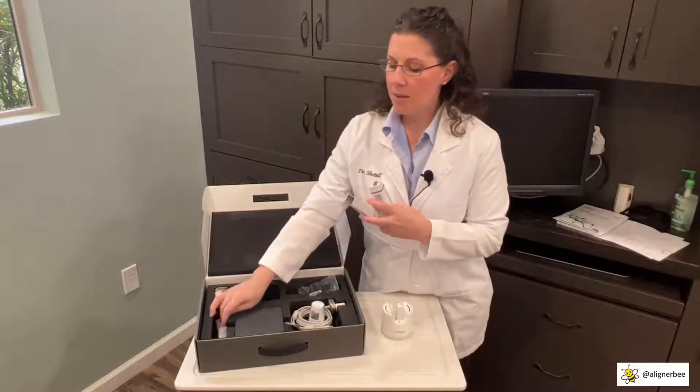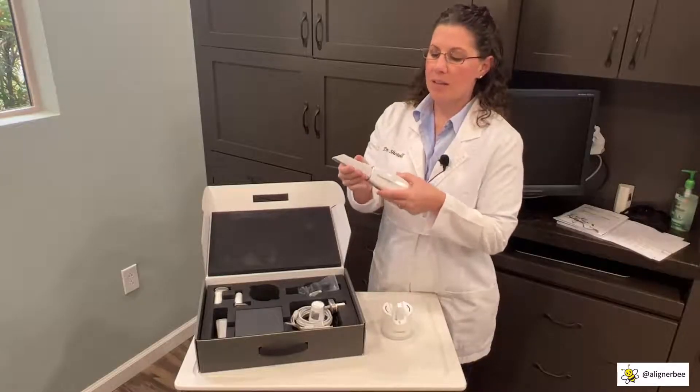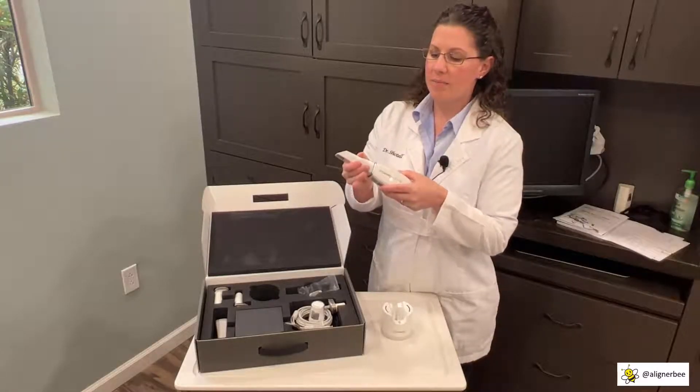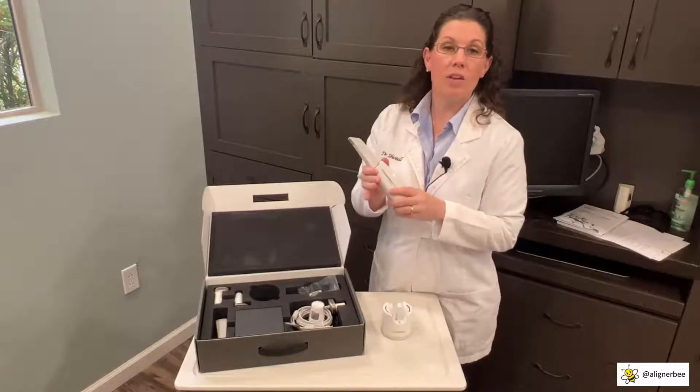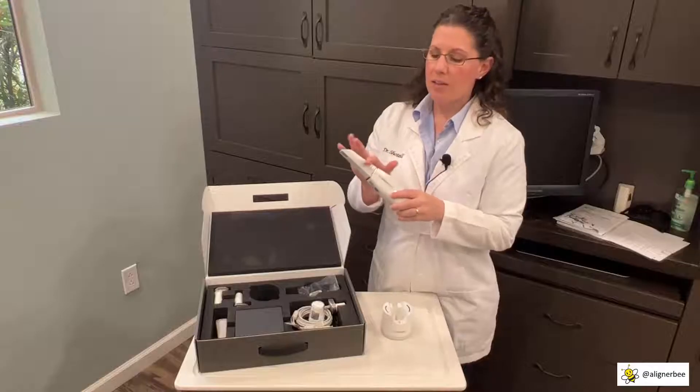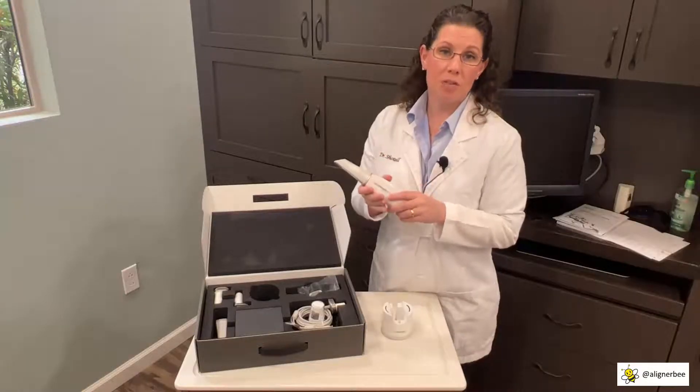Let's begin by using the traditional intraoral scanning tip. We're simply going to click it on the end. You heard an audible click so you know it's fully engaged, and you can see how easily it fits on and can be removed for sterilization.